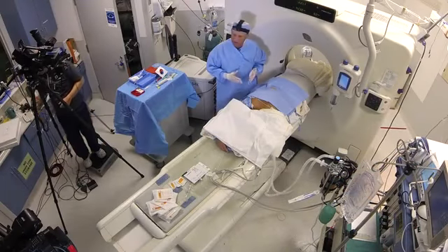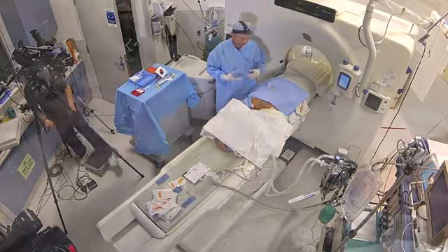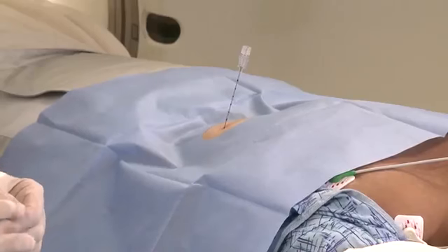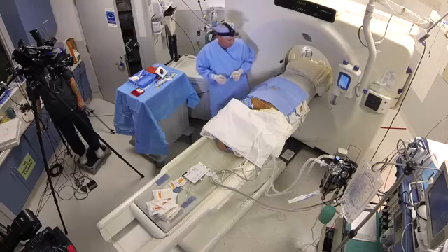It's worked out well. Initially I thought maybe the biopsy might lead to some bleeding that would obscure the site. That hasn't been a problem at all. And actually, 2 of the first 3 that we biopsied were benign, which was surprising. Haven't had a benign one since then, which is a long time ago.